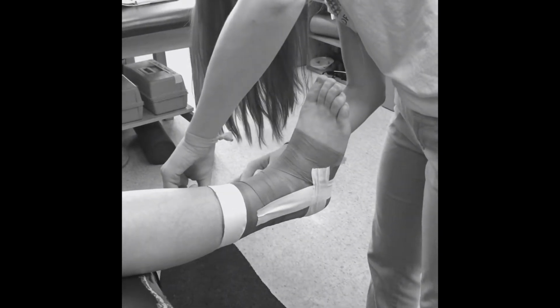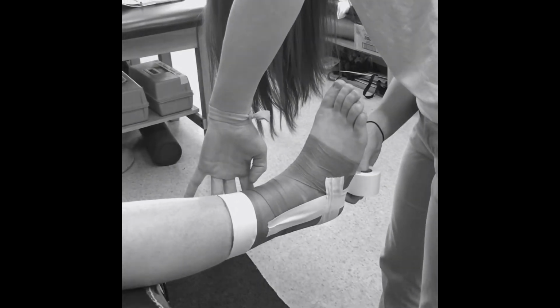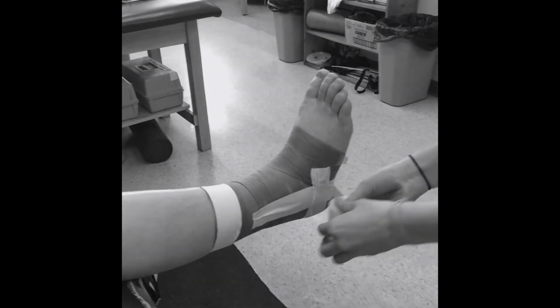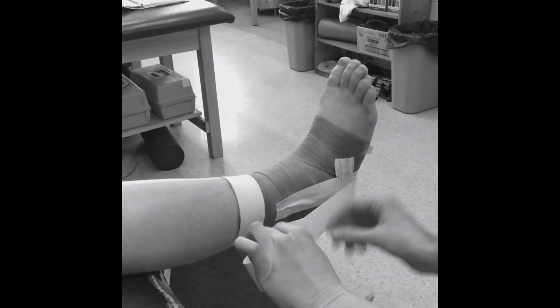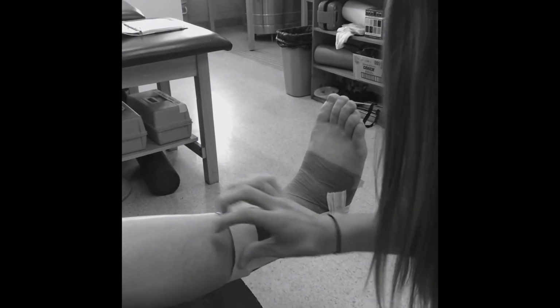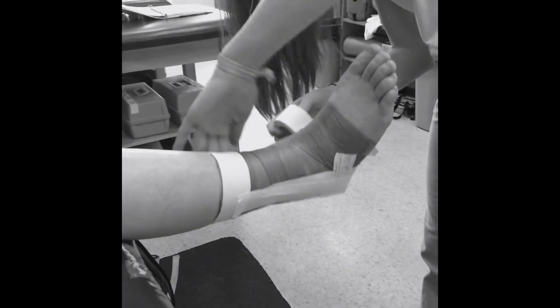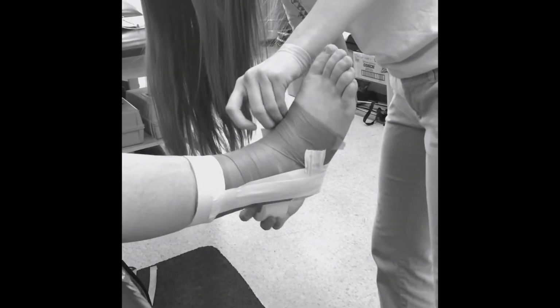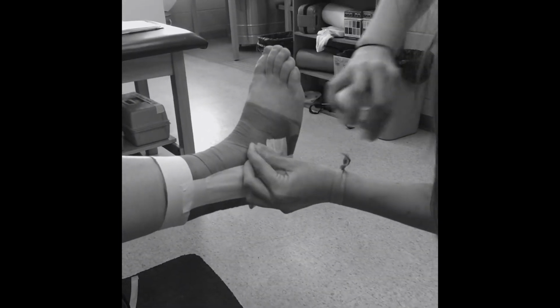You are now going to apply a second stirrup on the outside of your first stirrup, remembering to cover half of your first stirrup with the tape, remembering to pull from the medial side to the lateral side of the ankle. You are now going to apply your second horseshoe above the first horseshoe, remembering to cover 50% of the tape.